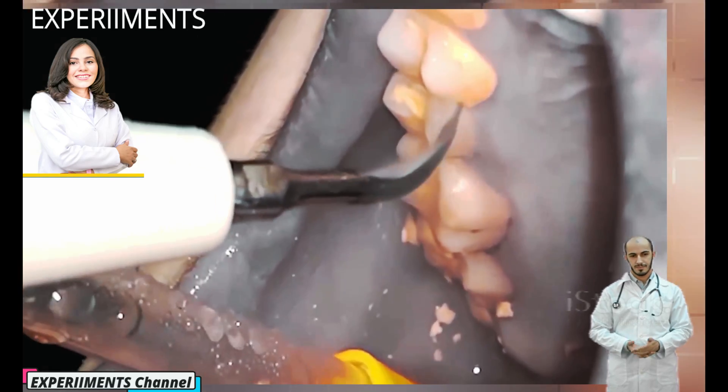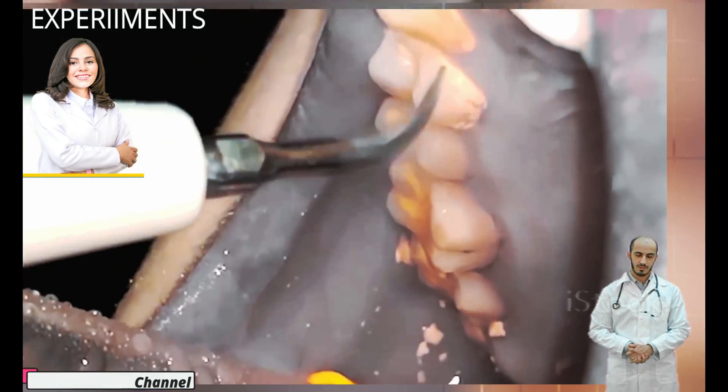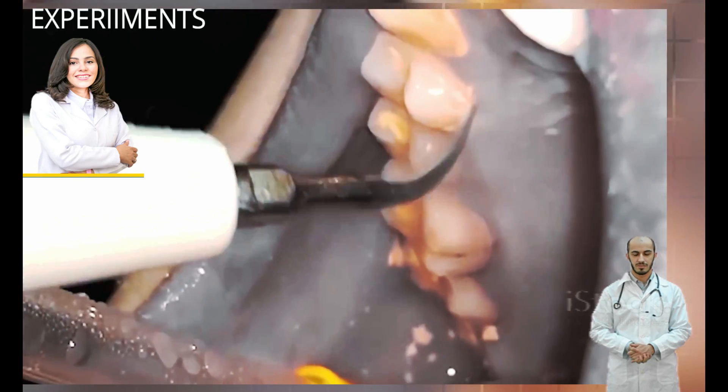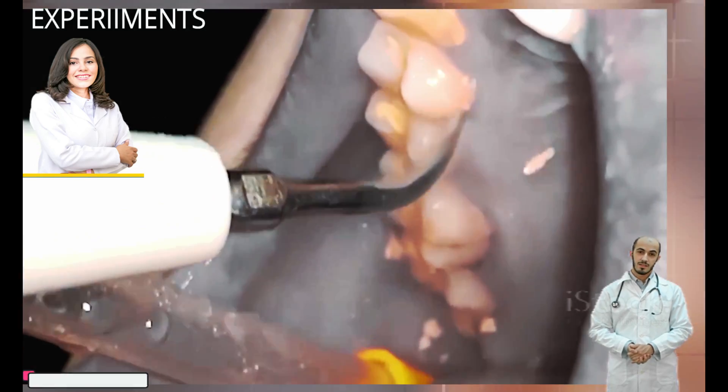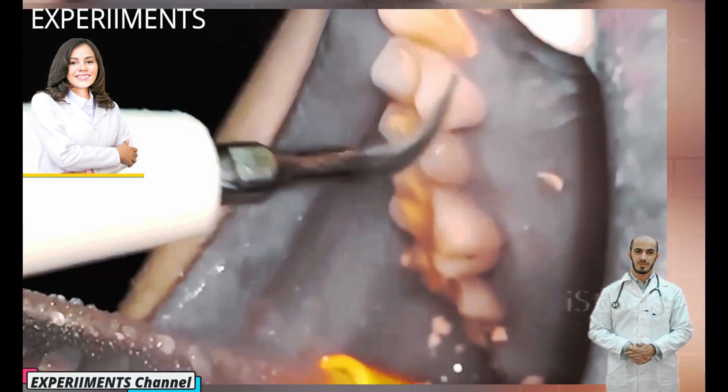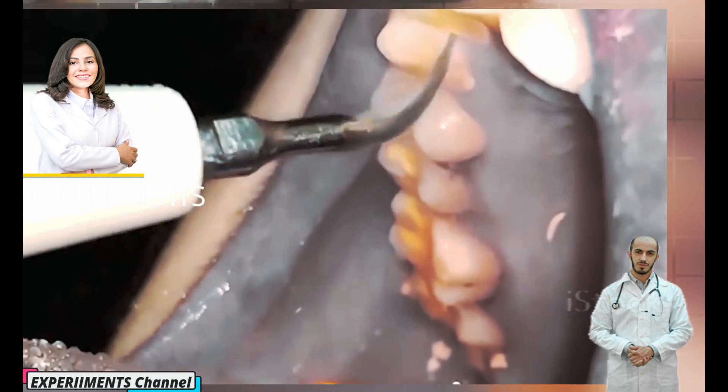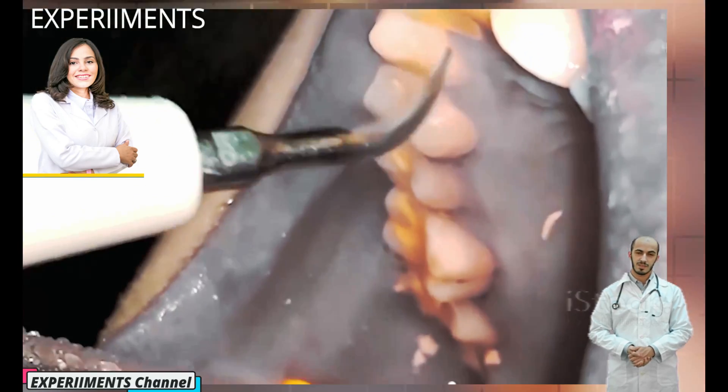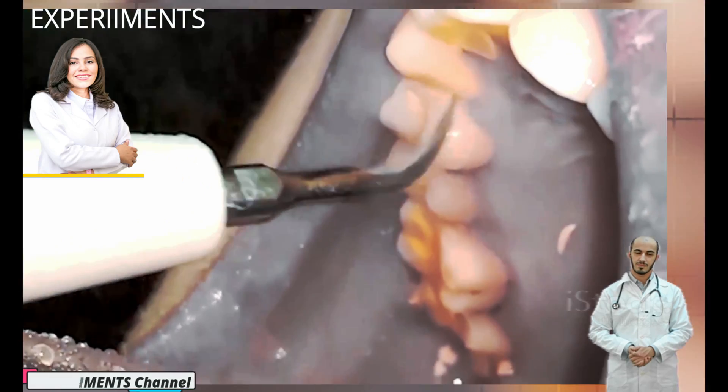As you can see, it's been a while since our patient had a cleaning. So what happens is the plaque that is not removed from the teeth, meaning the food and debris that is not brushed away, builds up on the tooth and it can only take up to 12 hours for it to harden into tartar.